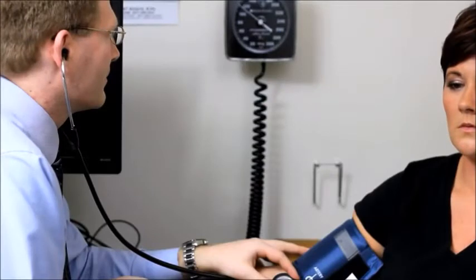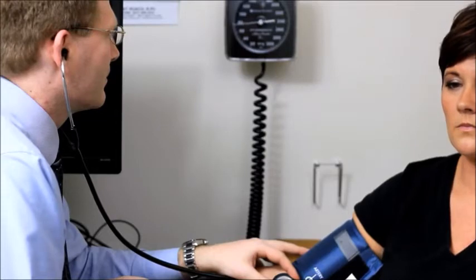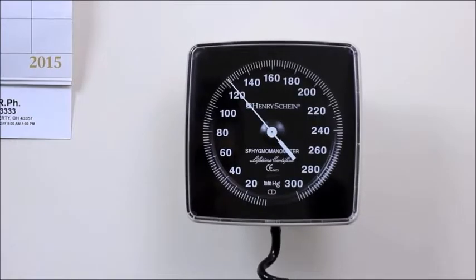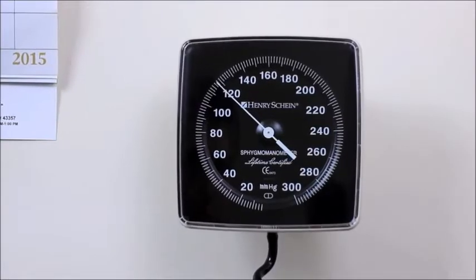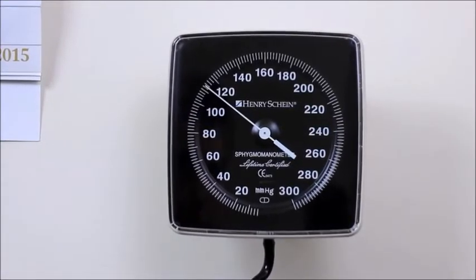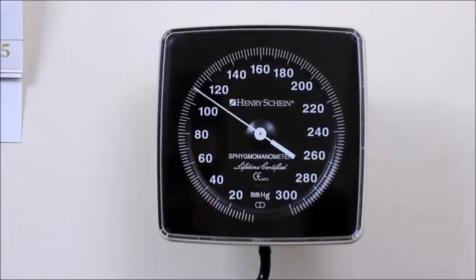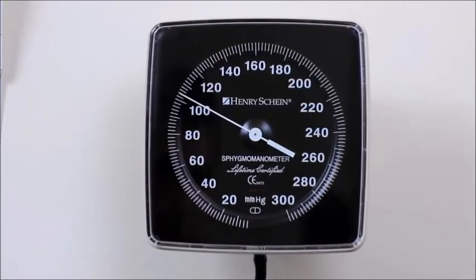As the pressure in the cuff is decreased, blood flow in the brachial artery increases, which creates turbulence and generates Korotkoff sounds. Phase I Korotkoff sounds are clear tapping sounds that coincide with reappearance of a palpable radial or brachial pulse. Systolic blood pressure is determined by the onset of Phase I sounds.